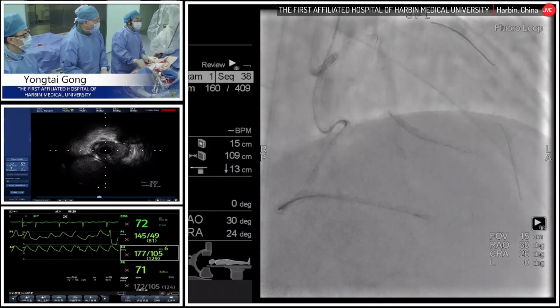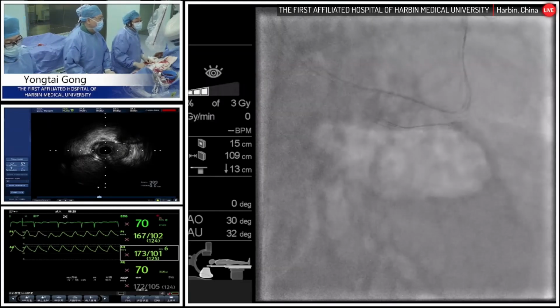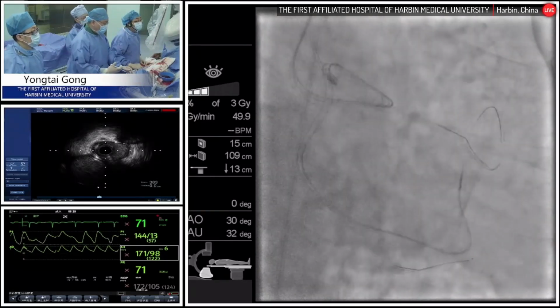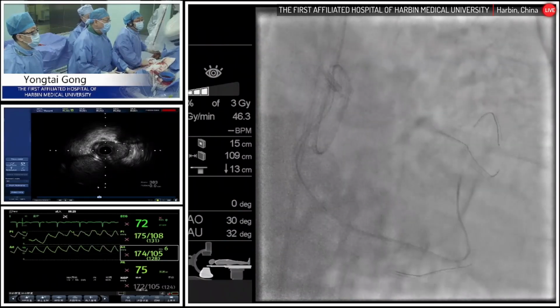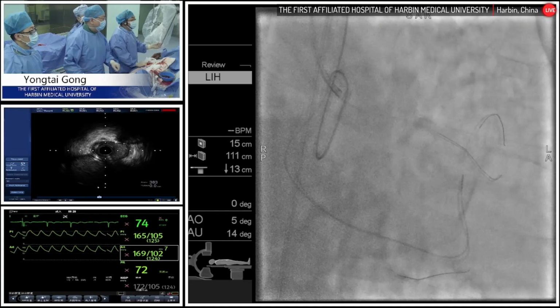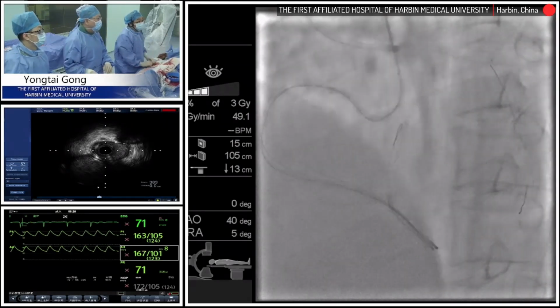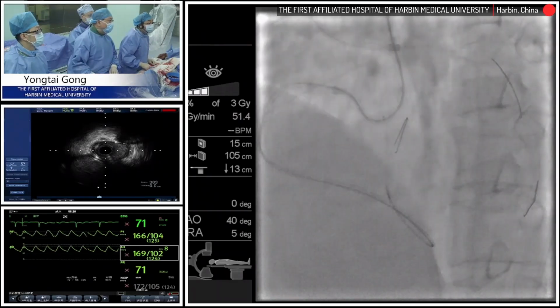Corsair microcatheter with a very good direction from the tip. We can see that several wires have been combined together to increase the support of this microcatheter. And also, I think Corsair is famous for its unique usage, with rotation to push the microcatheter to go through. The tip of the microcatheter has some hydrophilic coating, with 60 centimeters, and also a relatively very good visualization at the tip part of the microcatheter to help you identify the direction as well as the engagement of the microcatheter.